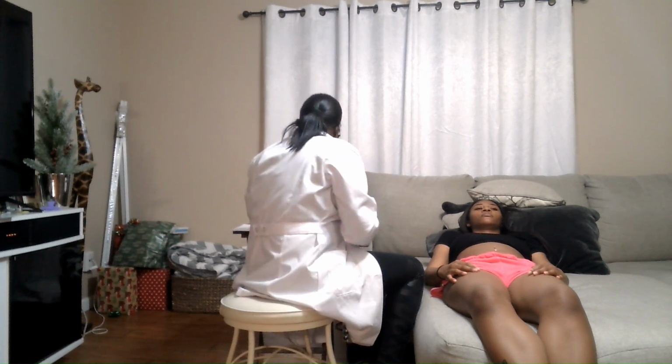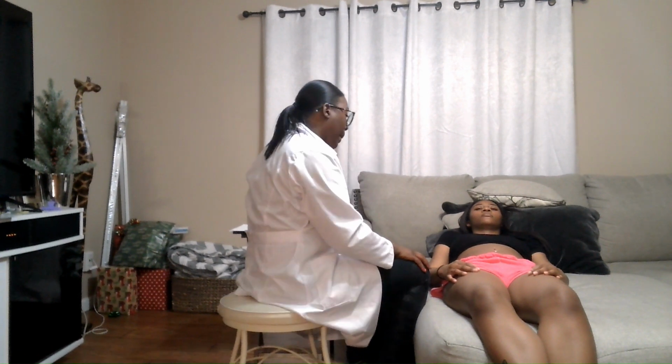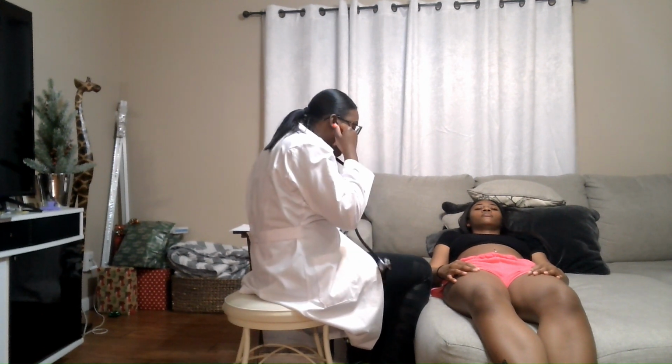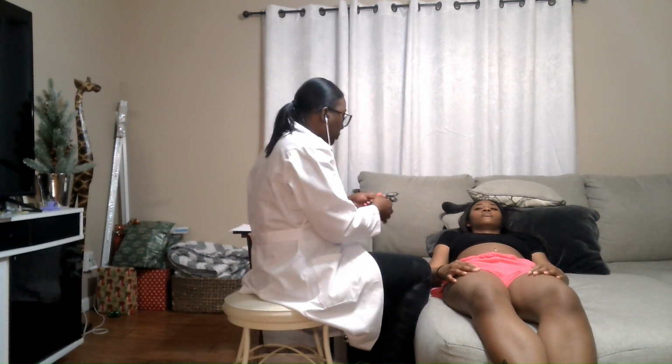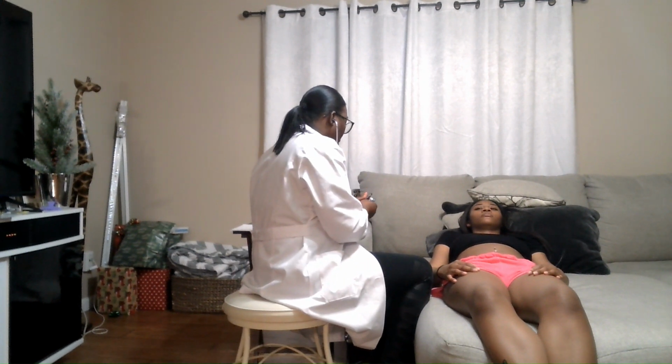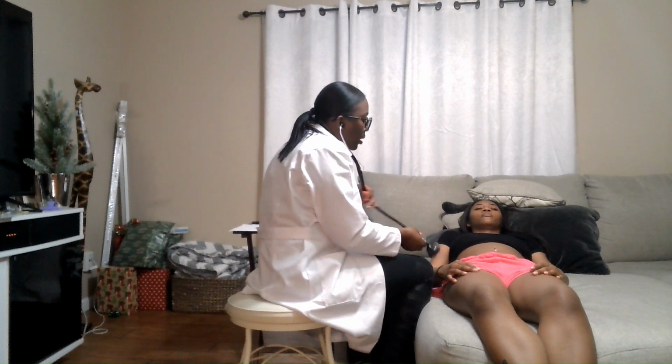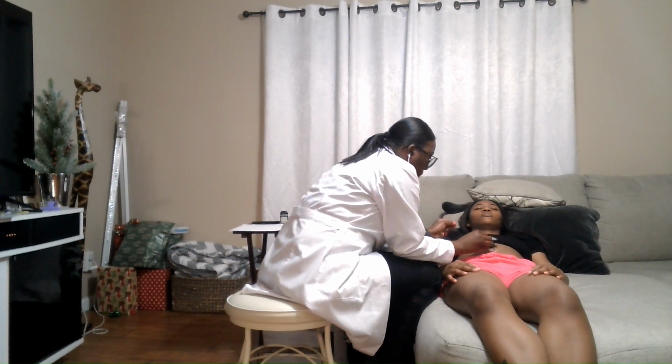Now I'm going to assess for bruits before I do my percussion part, so I'm going to get that out of the way. So I'm going to use the bell of my stethoscope, and I'm going to listen in. I'm checking for any bruits. I'm listening in the epigastric area, or the aortic area, epigastric area.